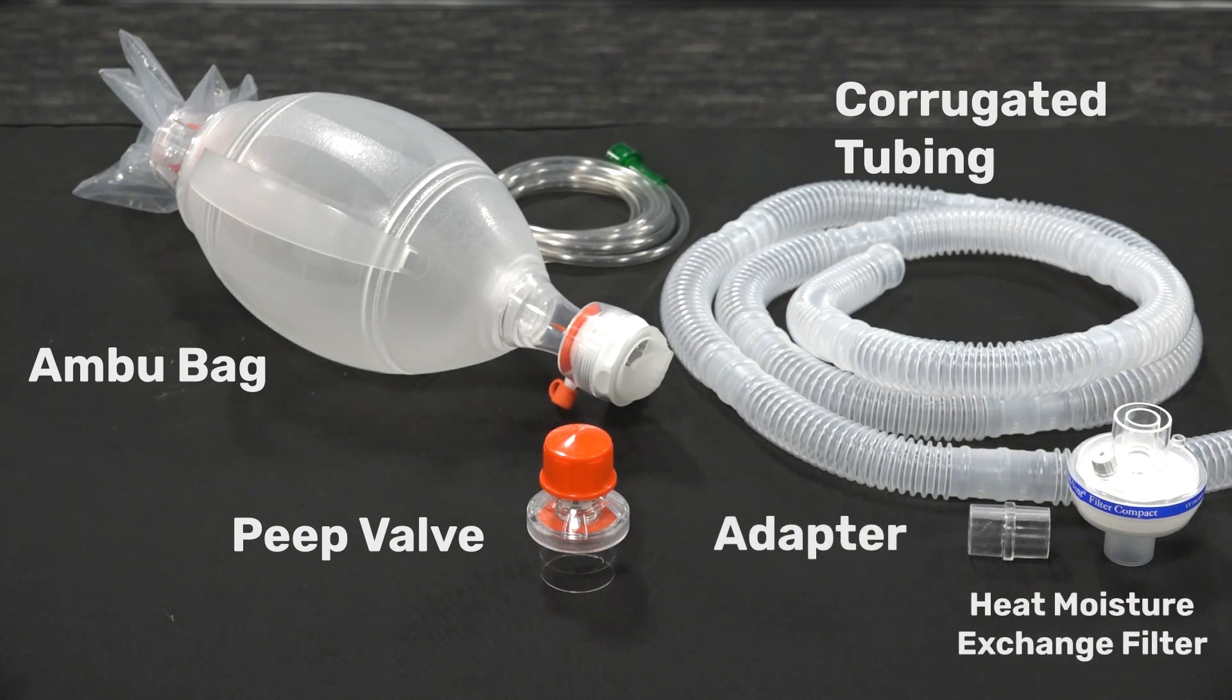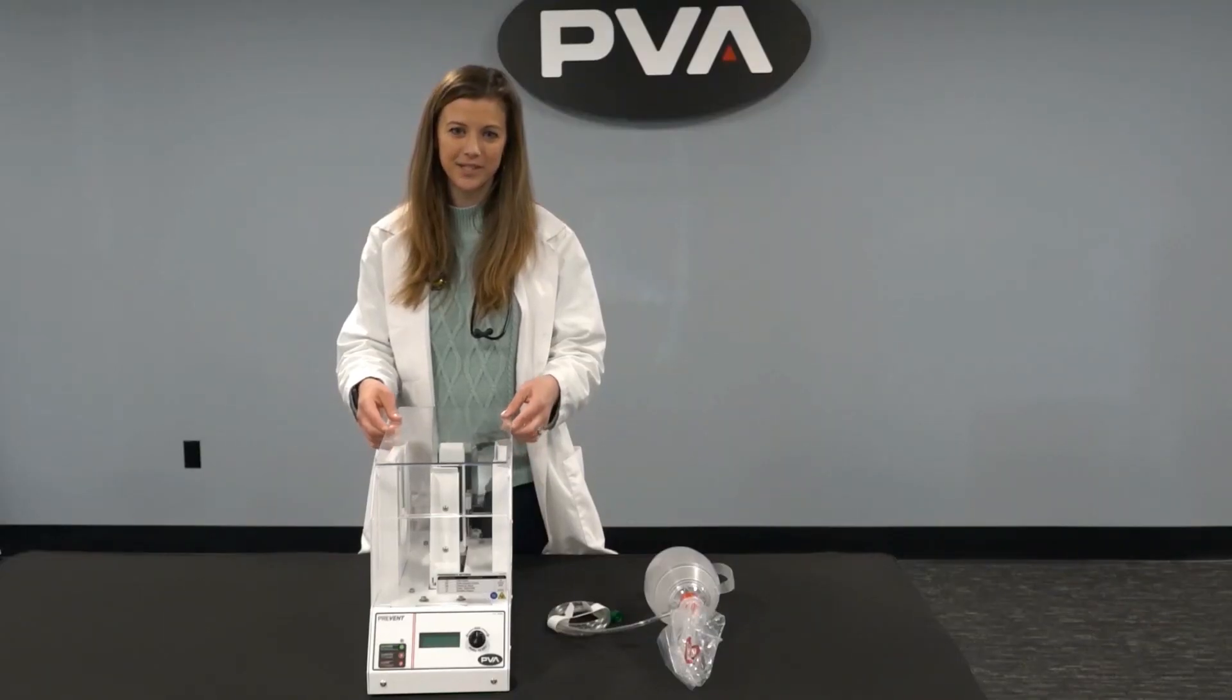Prevent is designed for use with an inline heat moisture exchange filter for minimal dead space, low moisture output, and limited resistance. It is also compatible with a HEPA filter. To install the resuscitation bag, first remove the safety cover.